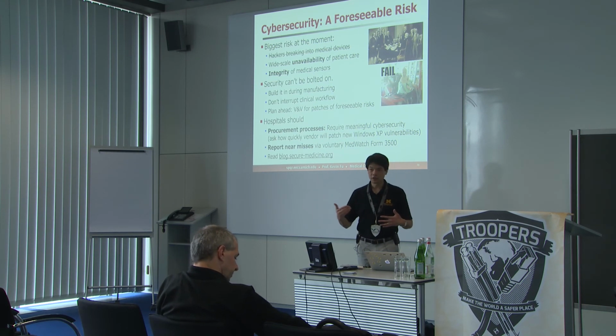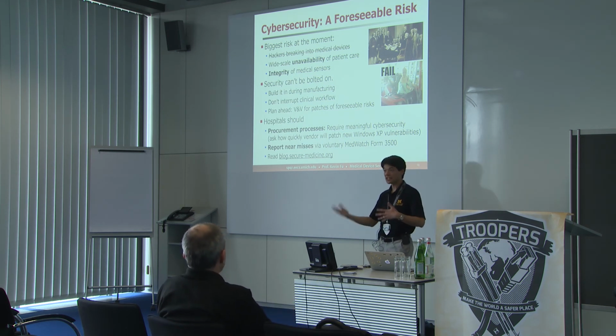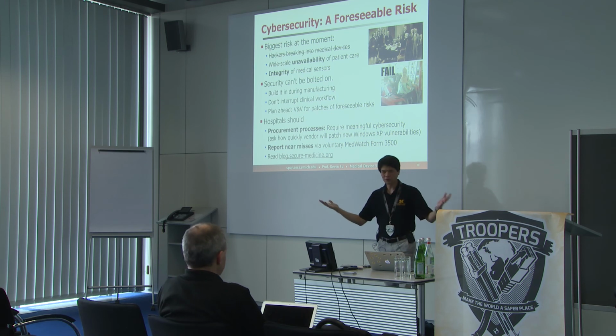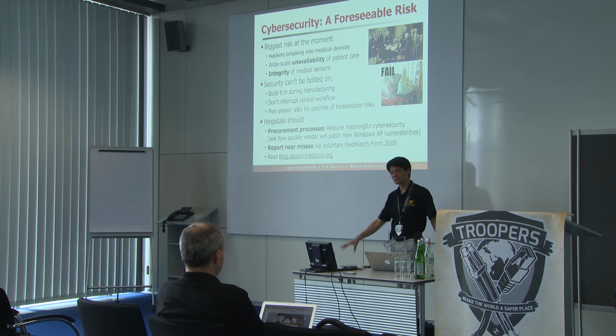Now, in practice, there are checks in place. It's a sort of sanity check. If your pulse were 1,000 beats per minute, I would hope the physician would say, no, something must be wrong with this device.